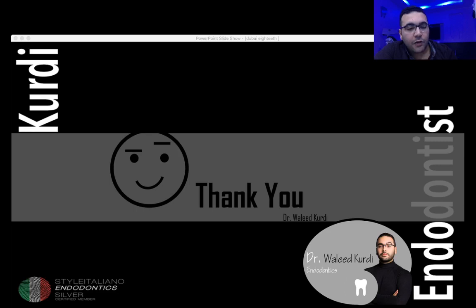Another question from Hard Work. Can you use Ultra X in a wide canal? Indeed. It will be very, very easy to use. Very easy to use. Any other questions, guys?